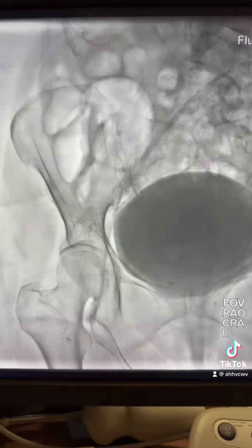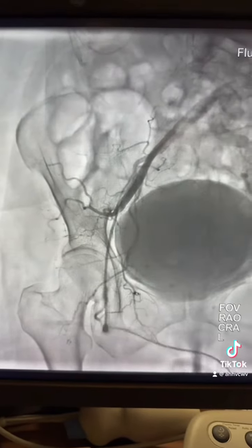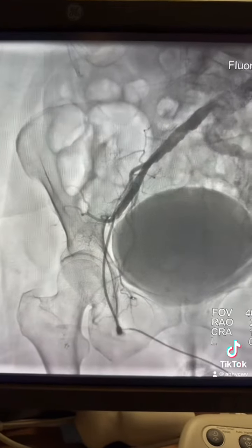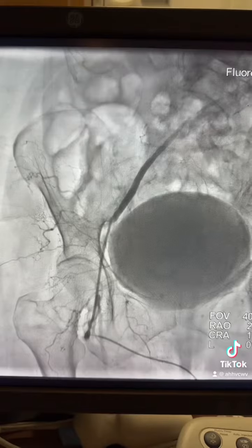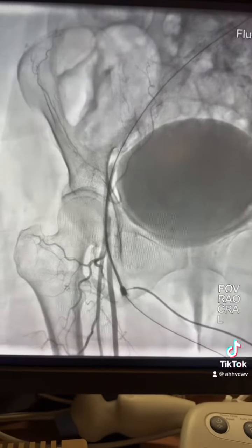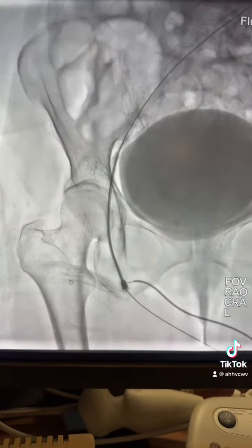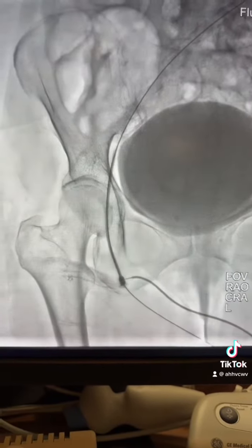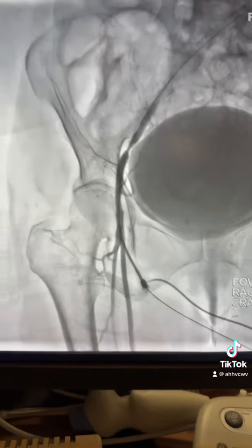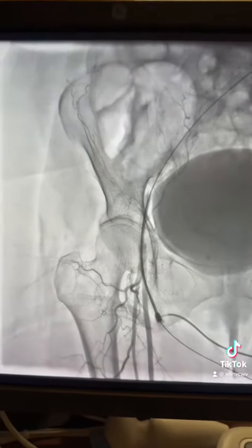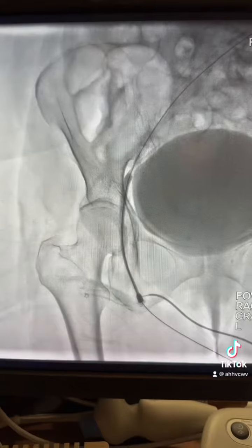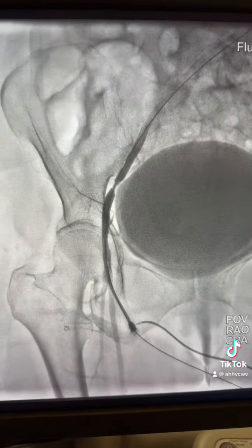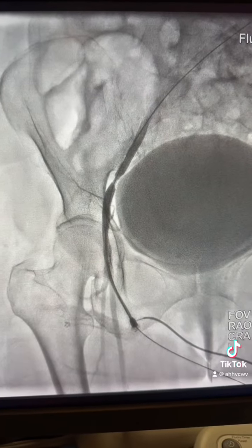At this point I stepped out. The tech was taking a picture of the femoral artery to close it, and you can see there is no flow distal to the sheath. Nitroglycerin was given, the sheath was pulled one inch distally, and you can see there is a tight lesion — 80% — in the external iliac.